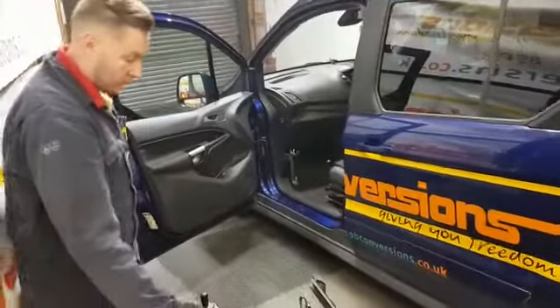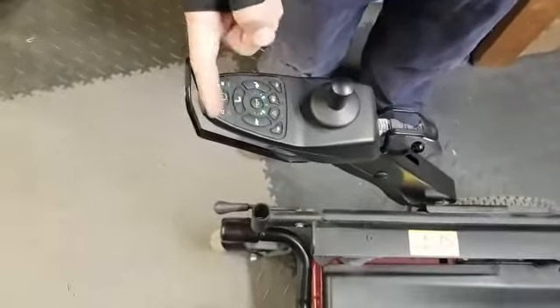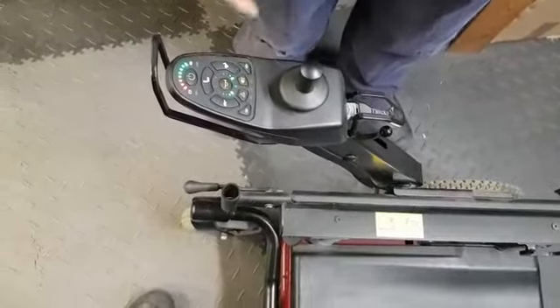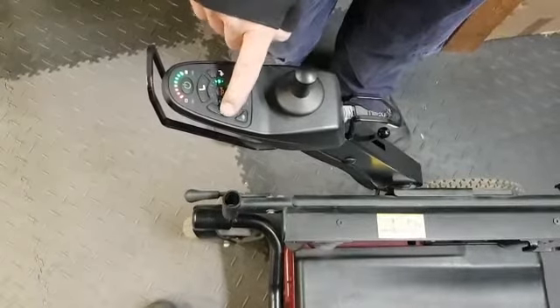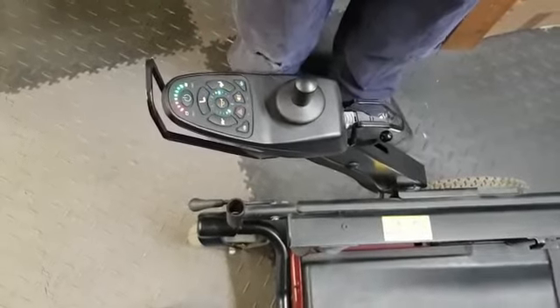Let me show you on here. As you can now see, you've got lots of different functions: you've got the horn, you've got hazards, and if you have the lights — which is an extra — you get front lights, and then left and right indicators. This button changes the functions so you can go up the speed and down the speed. And that's as simple as that.